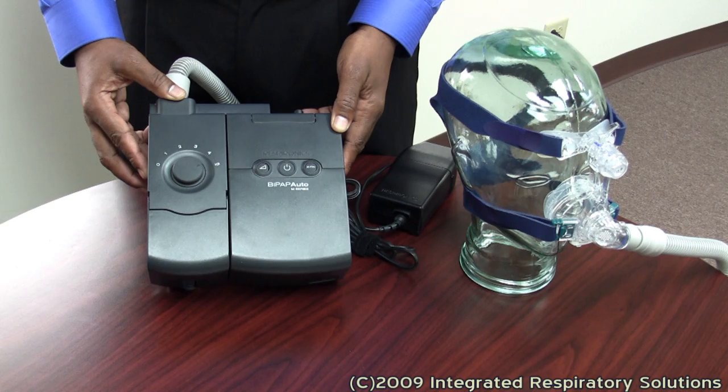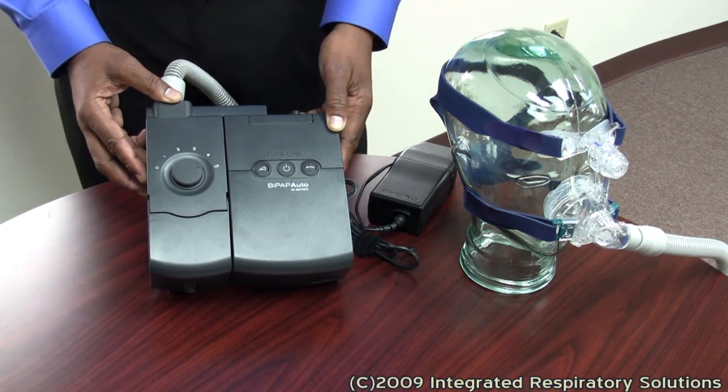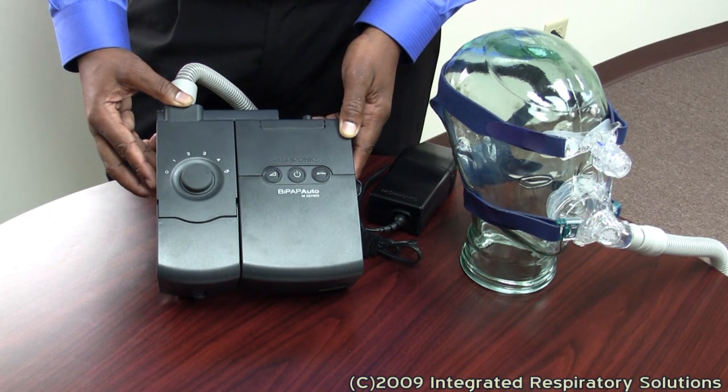BiPAP stands for Bi-Level Positive Airway Pressure. This means two pressures of air are delivered while you sleep: one when you breathe in, called your IPAP, and another when you breathe out, called your EPAP.